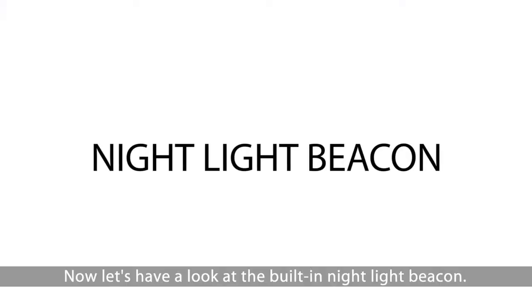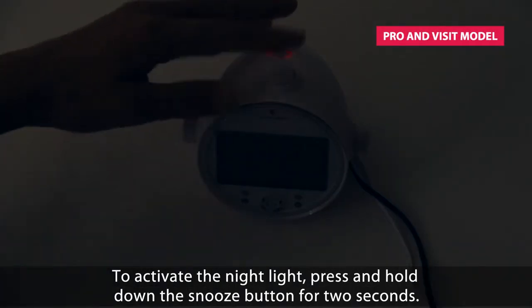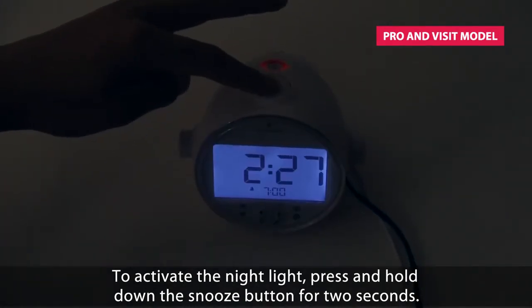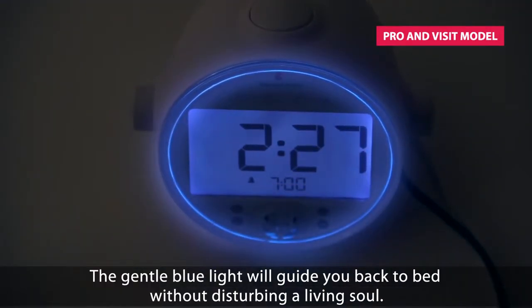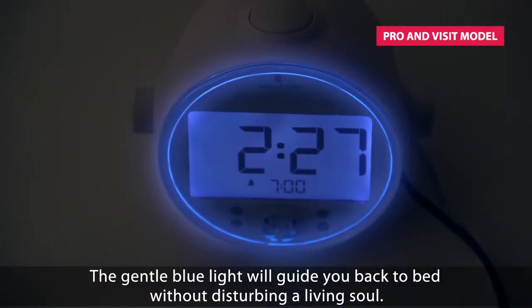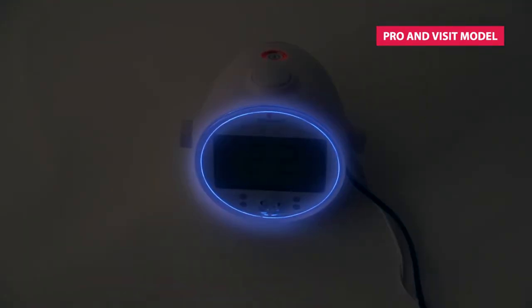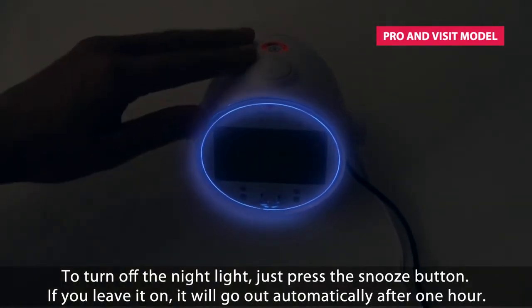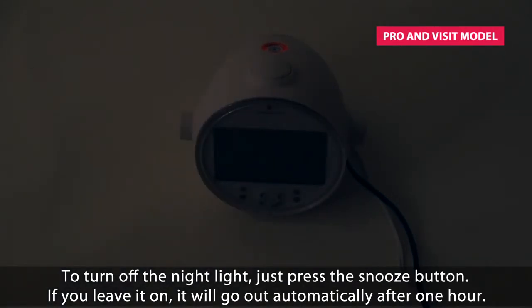Now let's have a look at the built-in nightlight beacon. To activate the nightlight, press and hold down the snooze button for 2 seconds. As you can see, it is now turned on. The gentle blue light will guide you back to bed without disturbing a living soul. To turn off the nightlight, just press the snooze button. If you leave it on, it will go out automatically after one hour.